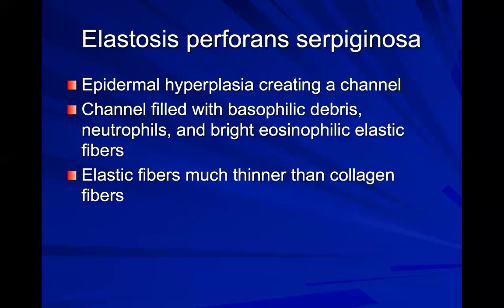Okay, now switching gears, we're going to talk about elastic tissue. You can perforate collagen, you can also perforate elastic tissue. So elastic tissue tends to be smaller. I don't know if that really has to do with it, but the channels I've seen for elastosis perforans serpiginosa tend to be smaller than the channels for perforating collagenosis.